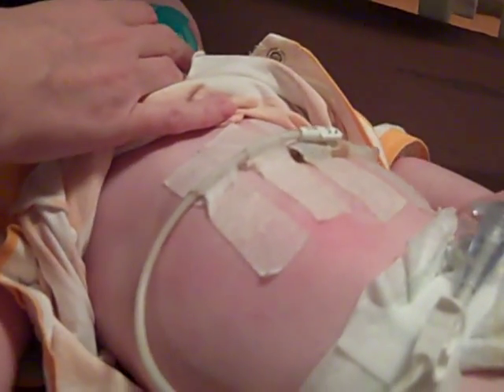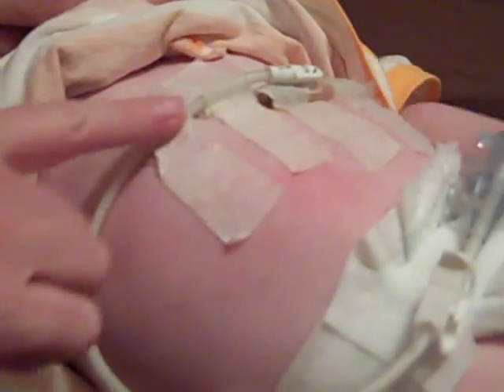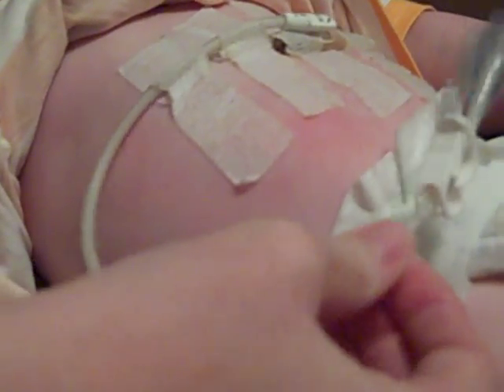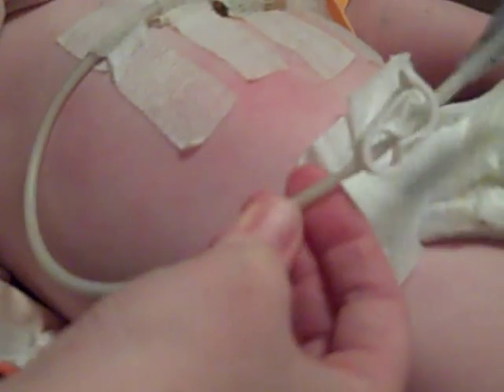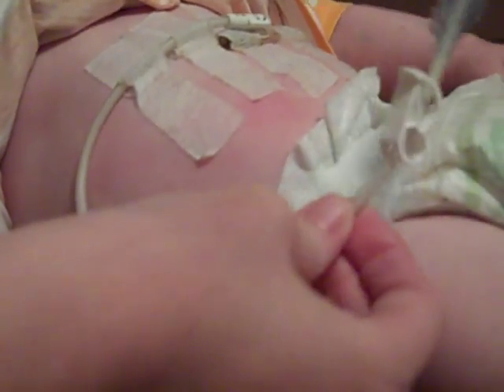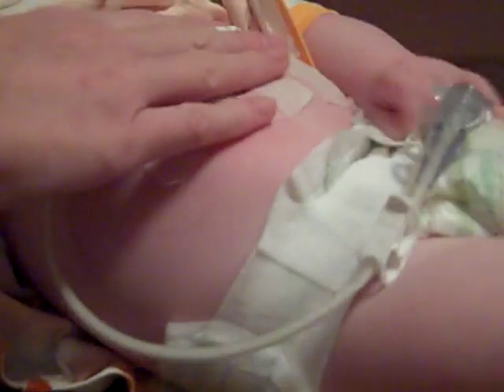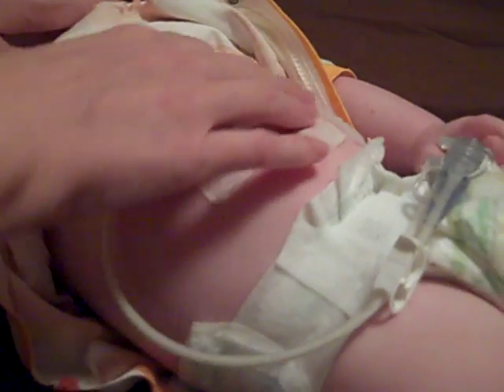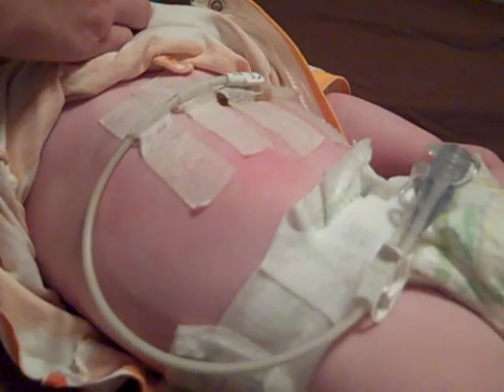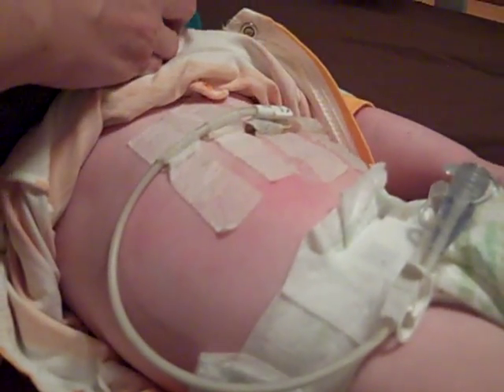Okay, tonight is bath night, and we are going to change Benjamin's tubing out. This tubing lasts about a week and a half. Sometimes it doesn't go that long, but it becomes really stiff, and then every time it moves, it pulls on the actual part of the Mickey button that's in right here. So we're going to go ahead and change that out, give him a bath, and then we'll show you how to put it back on.